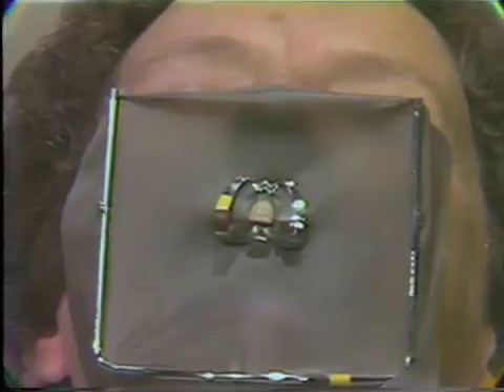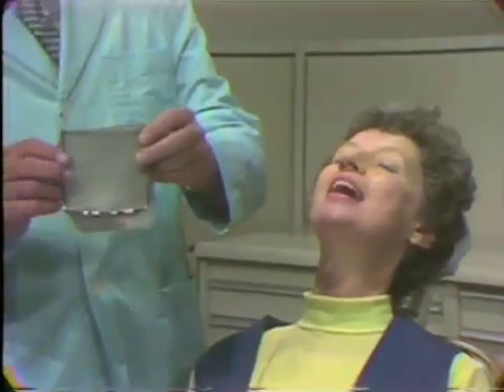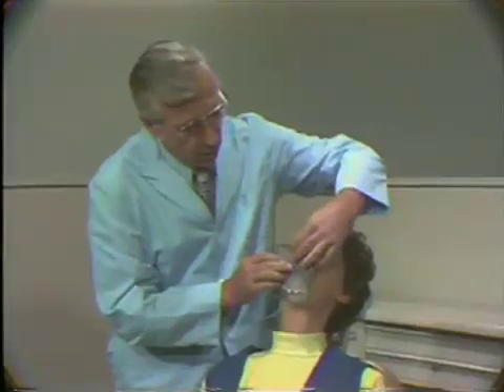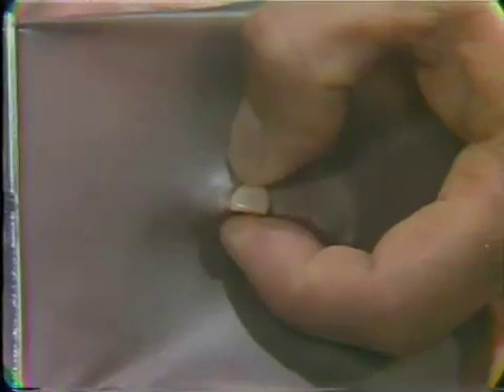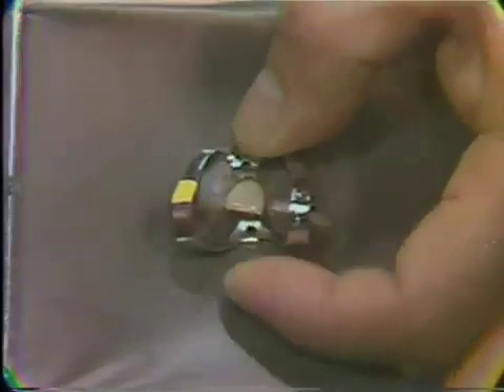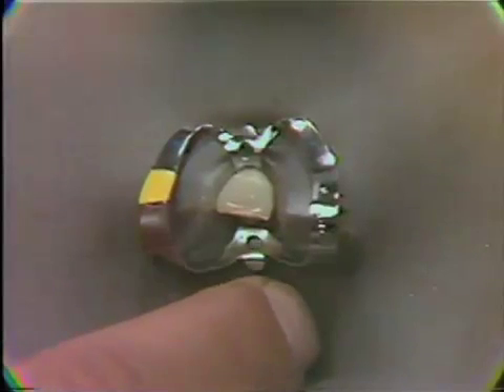At this point the saliva ejector would be placed in the mouth. An alternative method of placing a rubber dam is to have the rubber dam placed on the rubber dam frame with the hole punched in the proper position. The hole in the rubber dam is placed over the tooth to be isolated. With the thumb and forefinger of the left hand, the rubber dam is moved to the cervical, and the rubber dam clamp in the rubber dam clamp forceps is carried to the tooth, to the cervical. The rubber dam clamp forceps are then removed. The advantage of this method is that it is not necessary to remove the rubber dam material from the wings of the clamp.